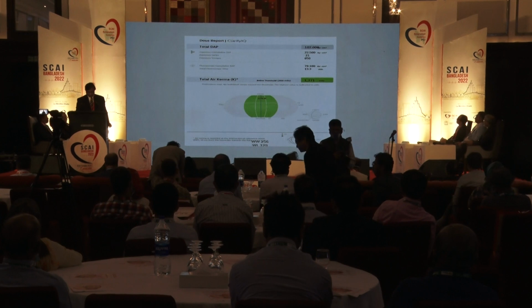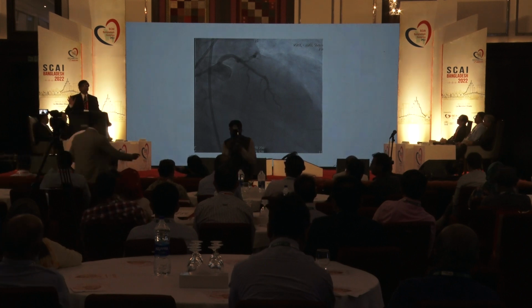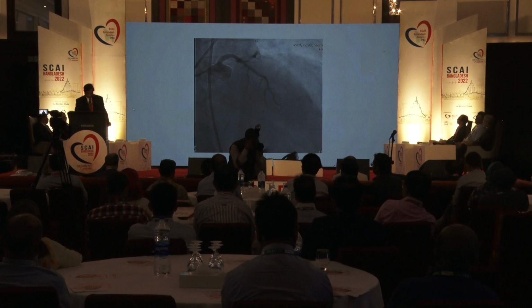So the diagnostic was done and then was sent to us. So we did the team approach. Patient wants PCI, we did the LAD, rotational atherectomy, and this was the final picture.